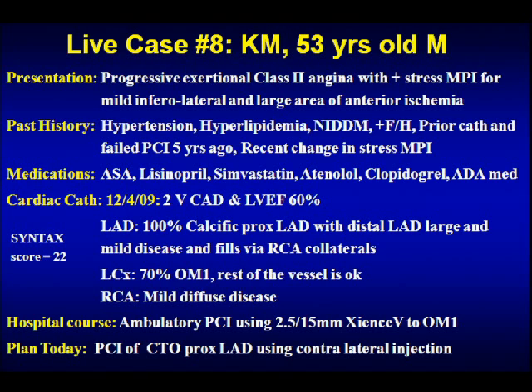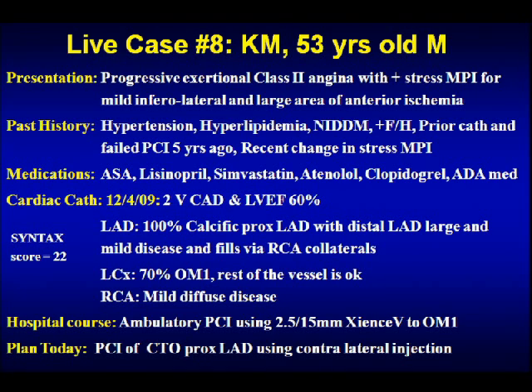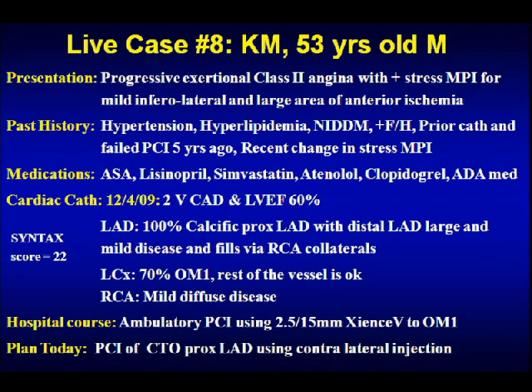Anu has already taken the angiogram. This is the LV gram today — EDP is about 14 to 15. You see the apex is a little dyskinetic, but otherwise the anterolateral wall almost up to the apex is coming in very nicely. The RCA is non-obstructive and you have grade three good collaterals to the LAD — through the septal as well as surface collaterals.